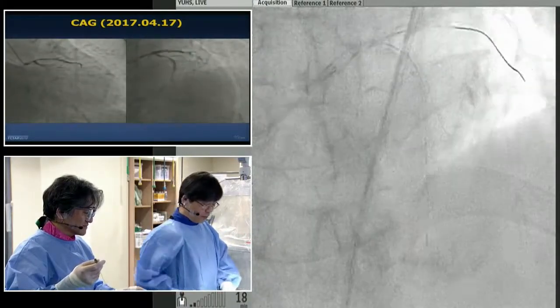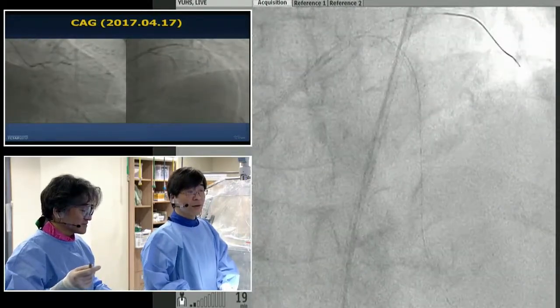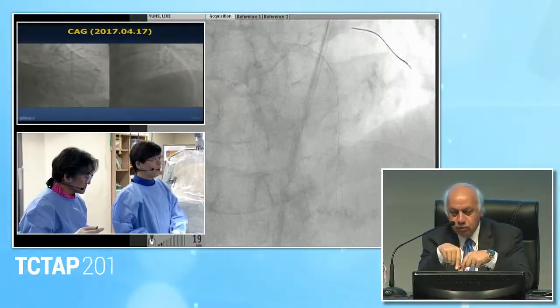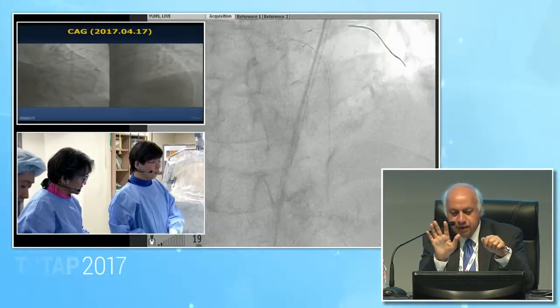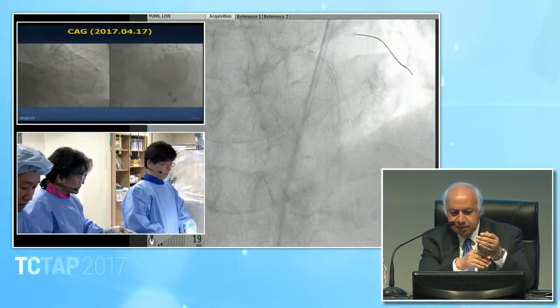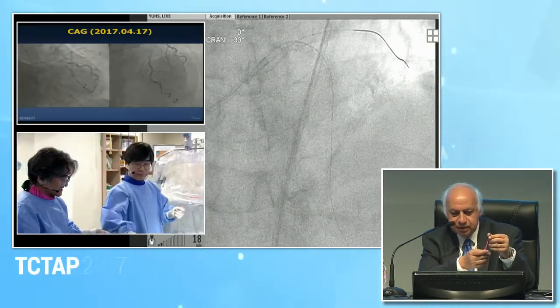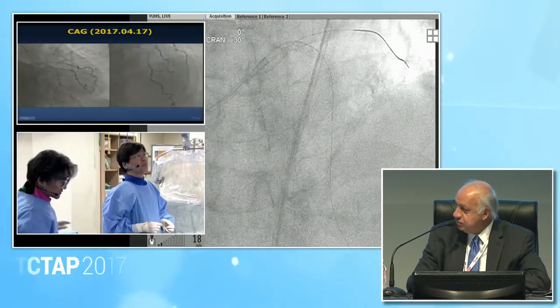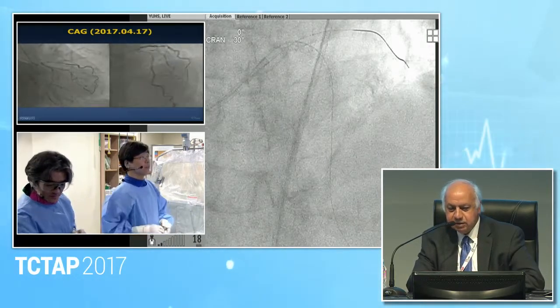Yeah, so far, nobody knows. Can I add to this? There is a software with Philips machine nowadays where you just do a single injection, and this calibration and delineation of the walls of the arteries, I mean the LAD and the CX, becomes the screen roadmap, and then you put the wire through this one without any contrast. Do you have an idea about this? No. This is the most updated machine, and I think this should be a future aspect to add to every machine, not to use contrast, just the computer adding the lines. So this is what they're using nowadays.